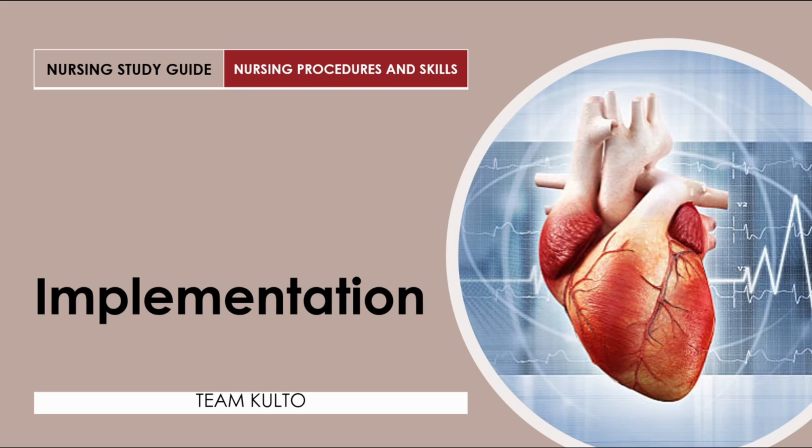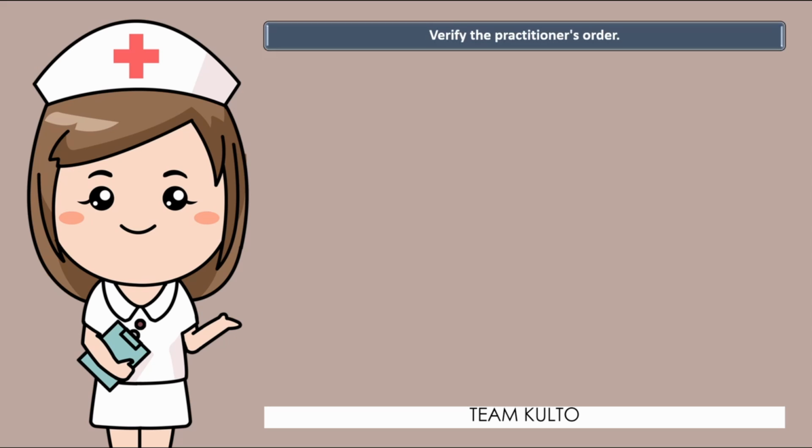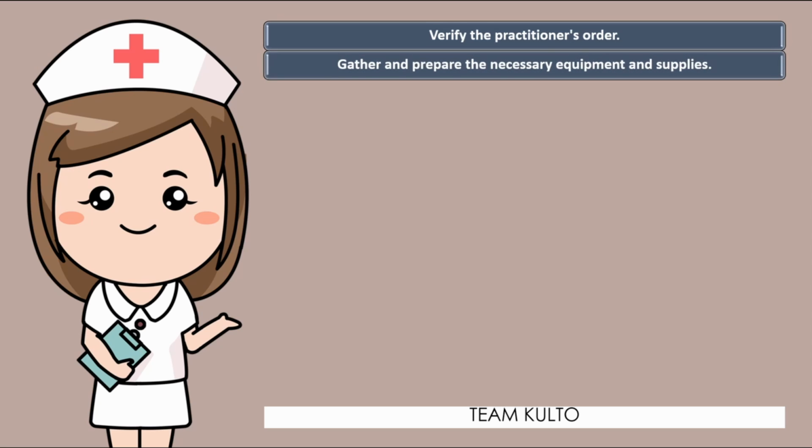Let's begin. Alright, so unang-una mong gagawin since nursing procedures ito, okay? Na una, you need to verify the practitioner's order. I-verify mo muna sa order ng doktor kung meron ba talagang order for ECG, kasi kung wala, it will be a waste of time and resources, girl. Gather and prepare the necessary equipment and supplies. Anong rationale behind for you to actually save time and effort?